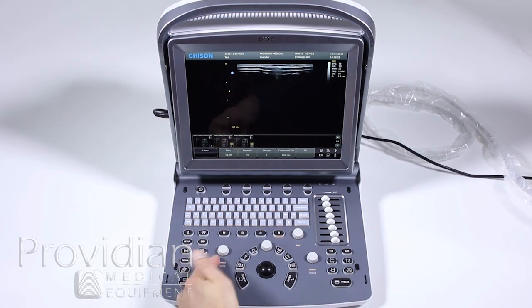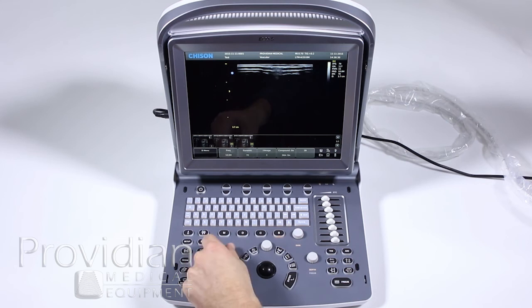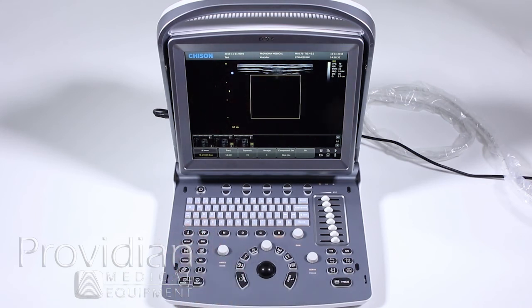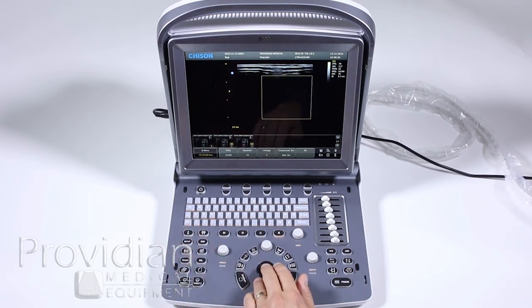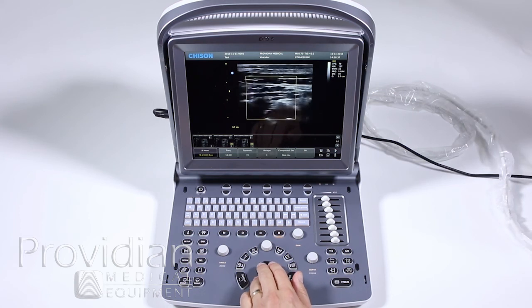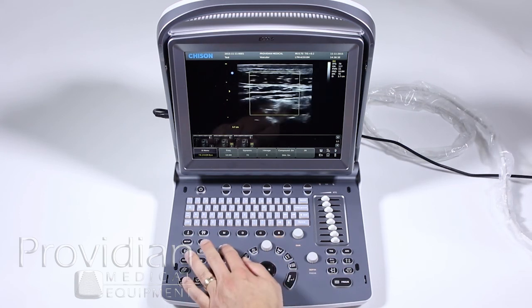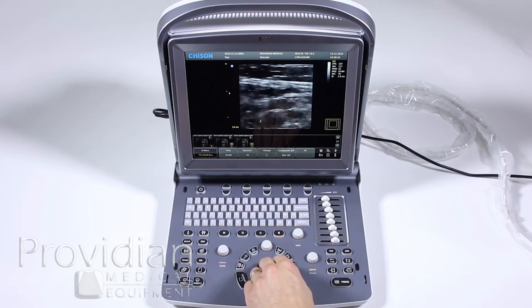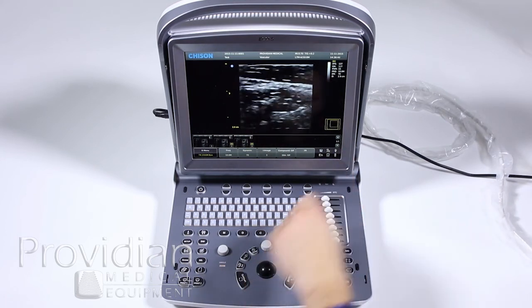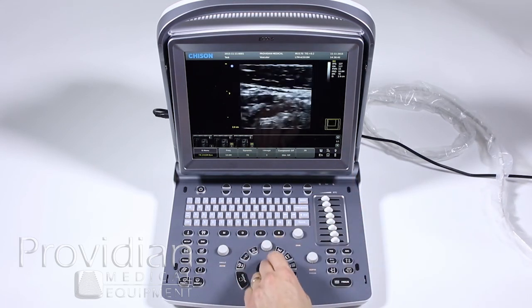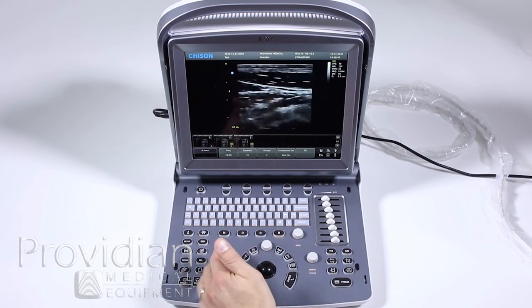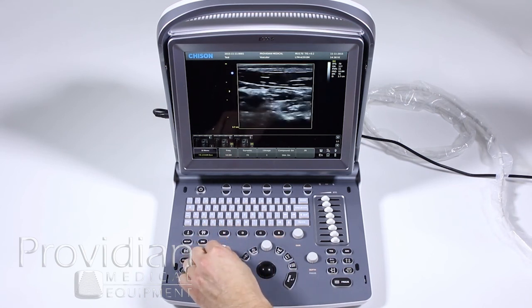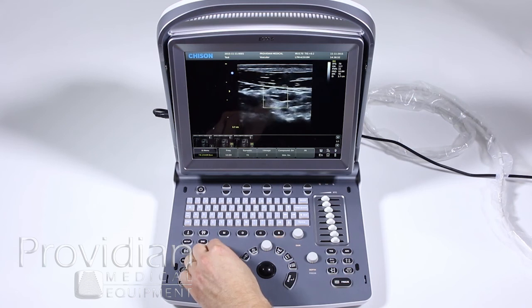Over here we have the zoom control. Right now it's at angle, so it won't do anything. To zoom, push the zoom button down, use the trackball to move around the area you want to see, and press zoom again to zoom in. You can see the trackball scrolls within the zoom area. Hit zoom again to exit. You can also twist to increase or decrease the zoom area size.